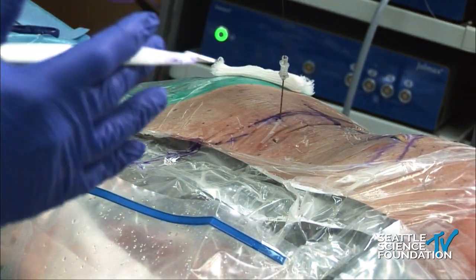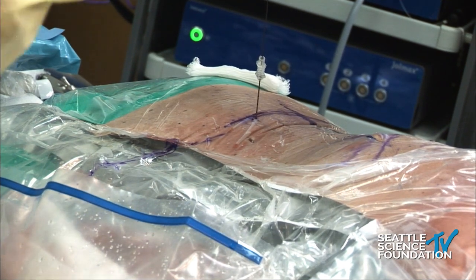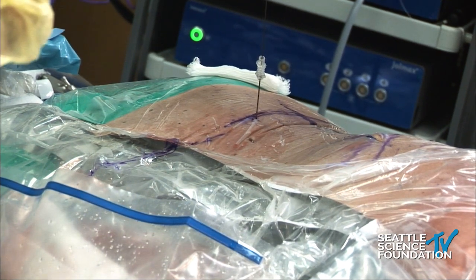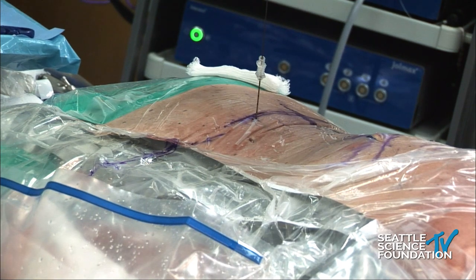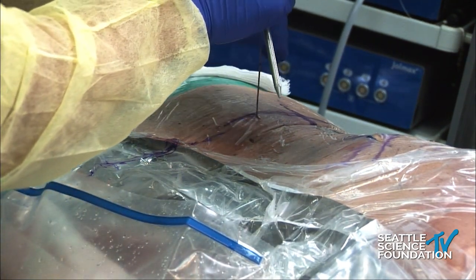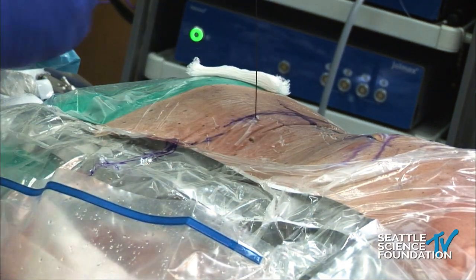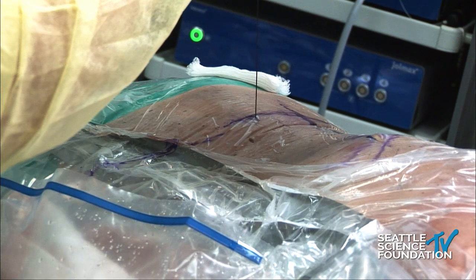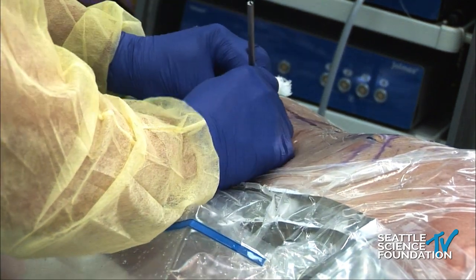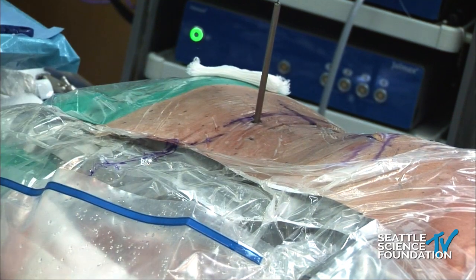So this is not an unreasonable spot to start. It's going to require resecting a little SAP to medialize the starting point of the disc, if that makes sense. So you want your cage going in just medial to the pedicle, going all the way across. Is that correct? Yeah, I want the implant to end up medial wall of the pedicle to medial wall of the pedicle, ultimately.